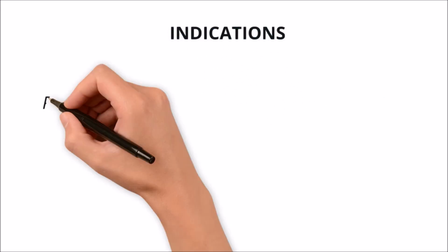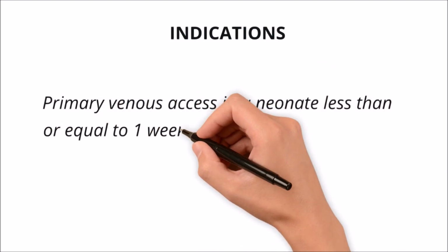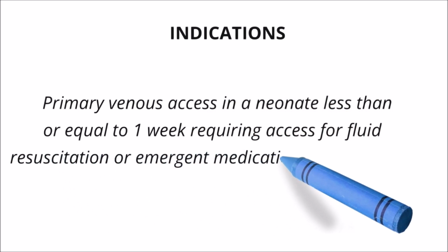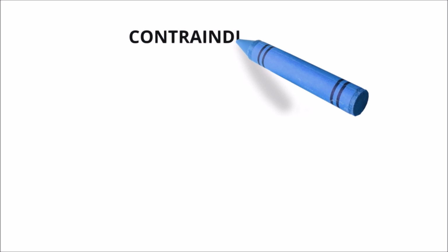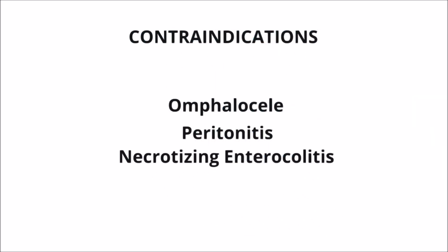Indications include primary venous access in a neonate less than or equal to 1 week, requiring access for fluid resuscitation or emergent medication administration. Contraindications include omphalocele, peritonitis, and necrotizing enterocolitis.